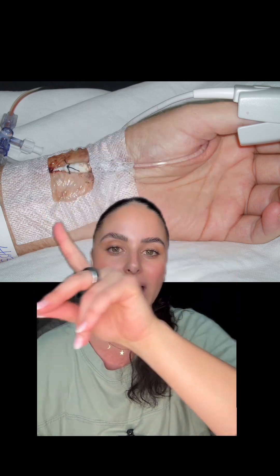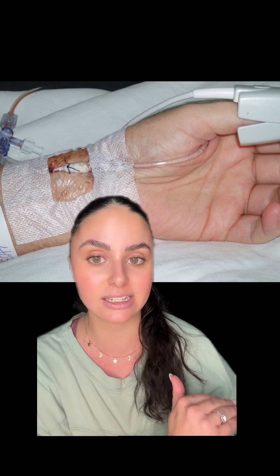If the site looks good, follow all the way back — check all your tubing for any bubbles or loose connections. Make sure your transducer is leveled at the phlebostatic axis and zeroed. Follow the tubing all the way back up to the pressure bag. Make sure your pressure bag is inflated to 300 mmHg, or to the little green tab, and that your saline bag inside the pressure bag is filled up.